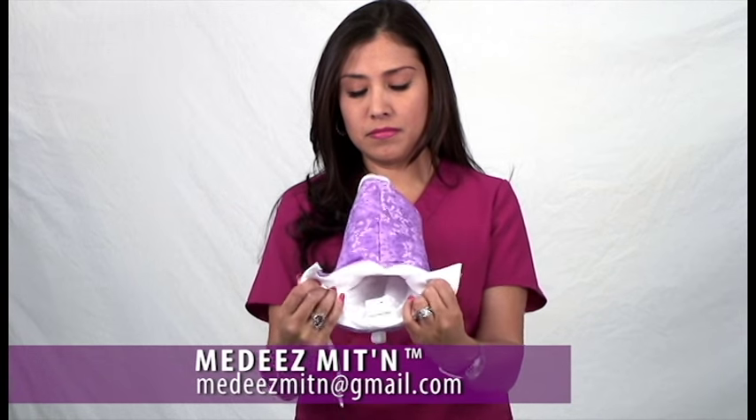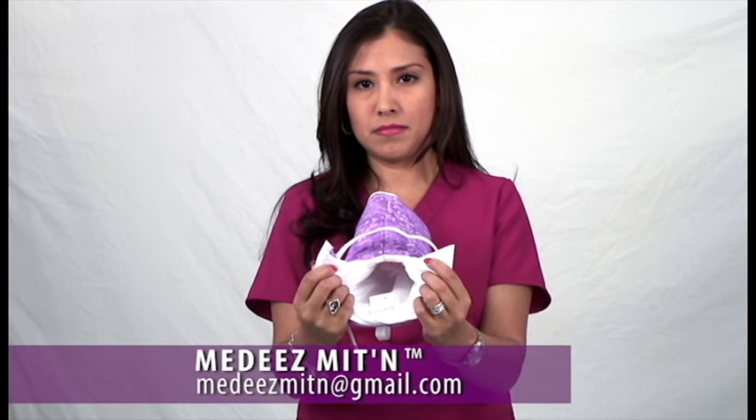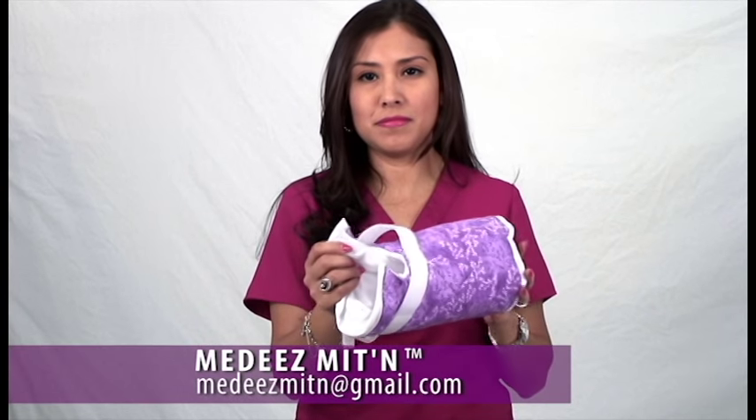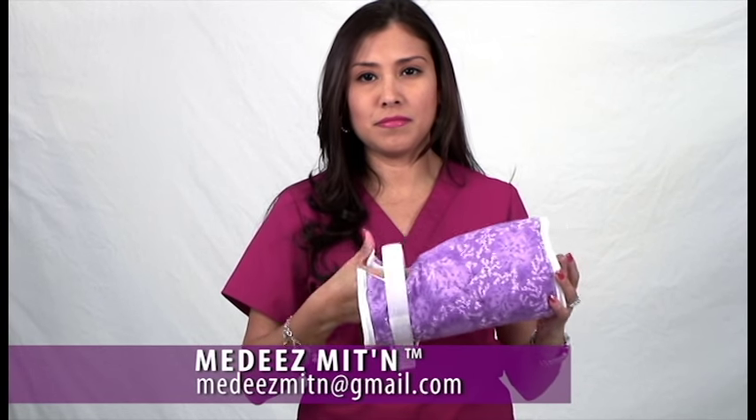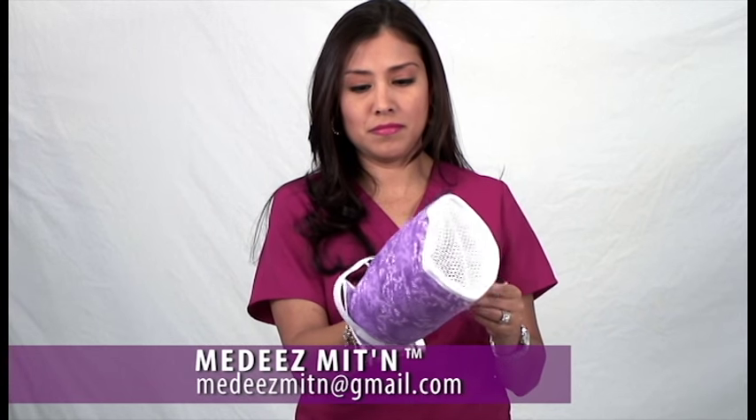The inner cushion provides pain-free comfort. The mittens have ample room for free hand movement and accommodate different hand sizes.